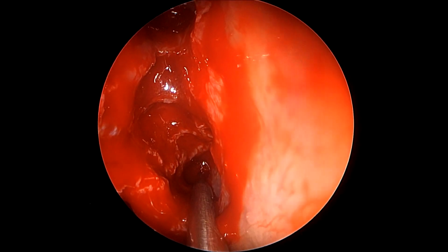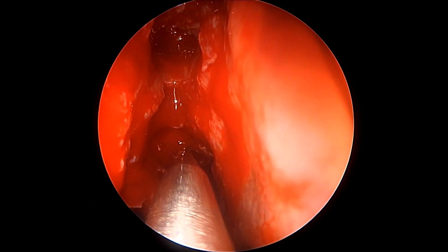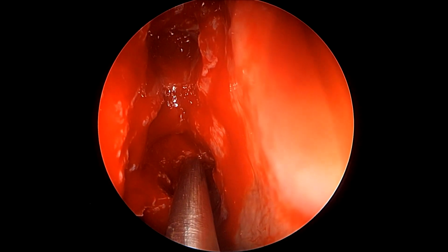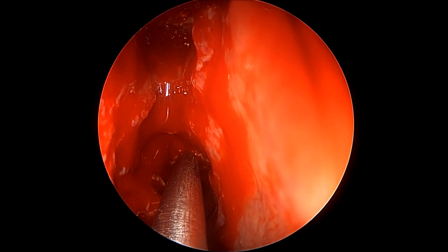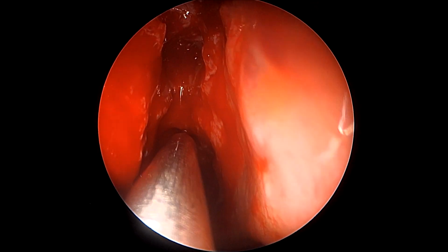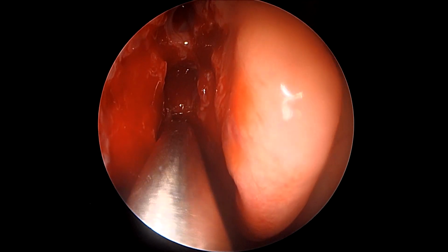Once again, we use our navigator probe to go inside straight towards the sphenoid sinus. The probe now points to the sphenoid floor, followed by the posterior ethmoidal roof. And as we come anteriorly, we shall go towards the anterior ethmoidal roof. There are some cell septations in the ethmoids which are still remaining and might need to be removed for complete clearance.